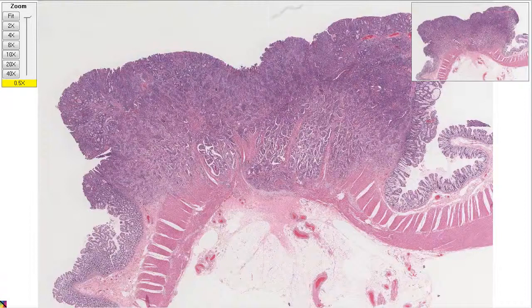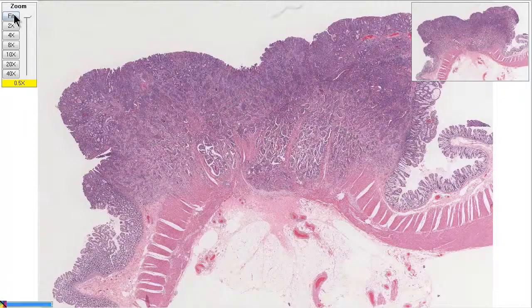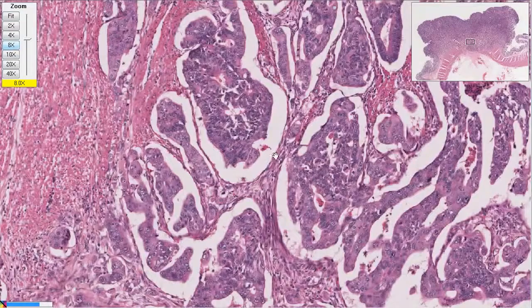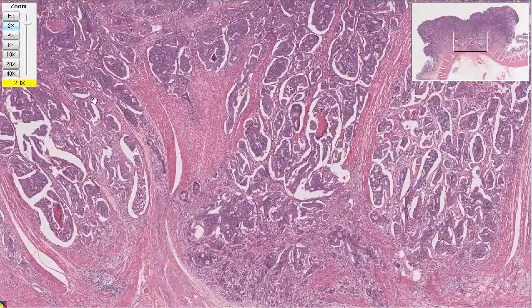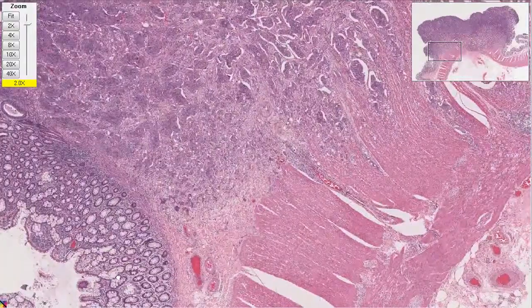Makes sense. So now we're back here, looking at the cancer, which probably, like you said, started here and is growing, spreading out all the normal tissue around it. Wow. And so we're going to look now at the cells. Zoom in. Hang on to your hat. Okay, so what we're going to do is first go into a lower power here, and look at the edges of this.